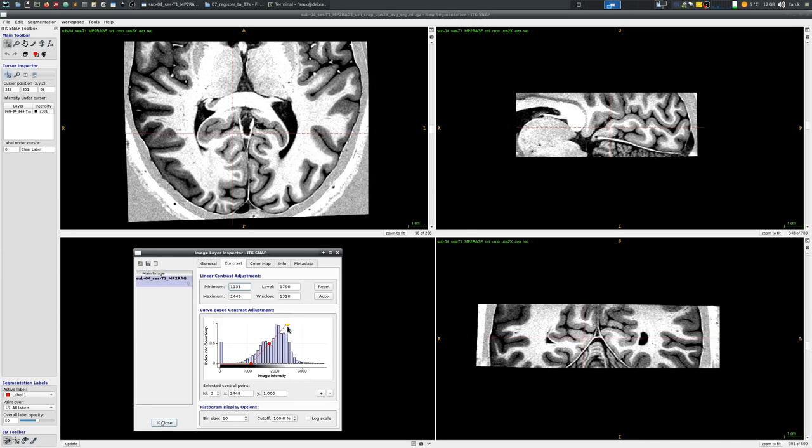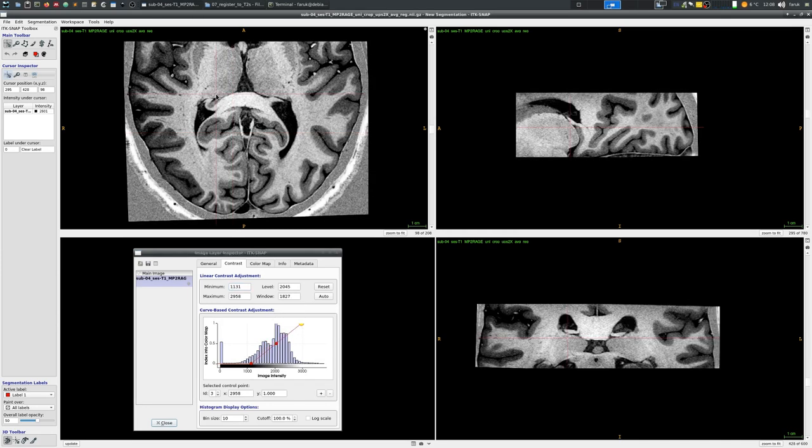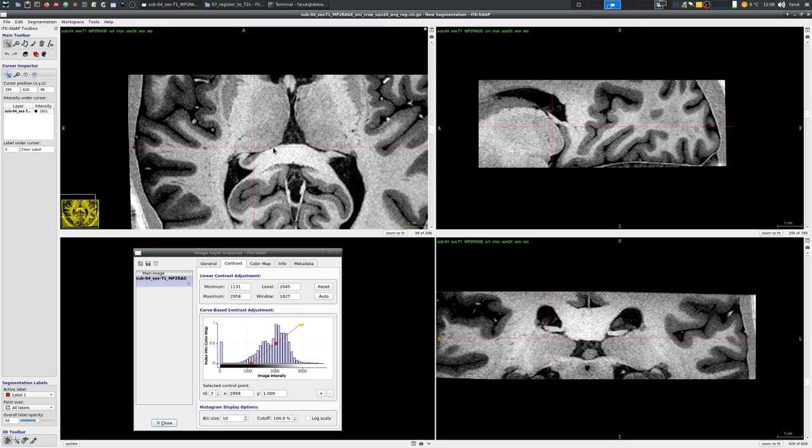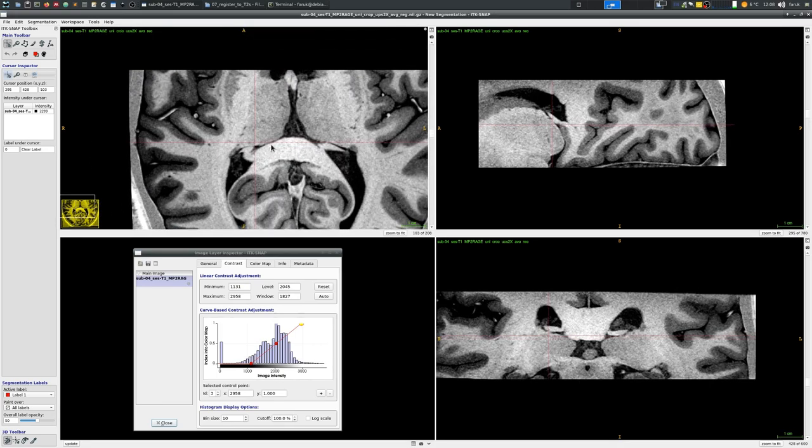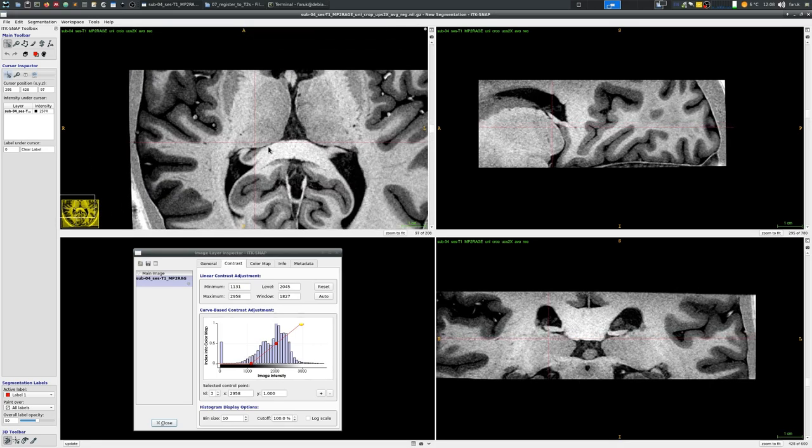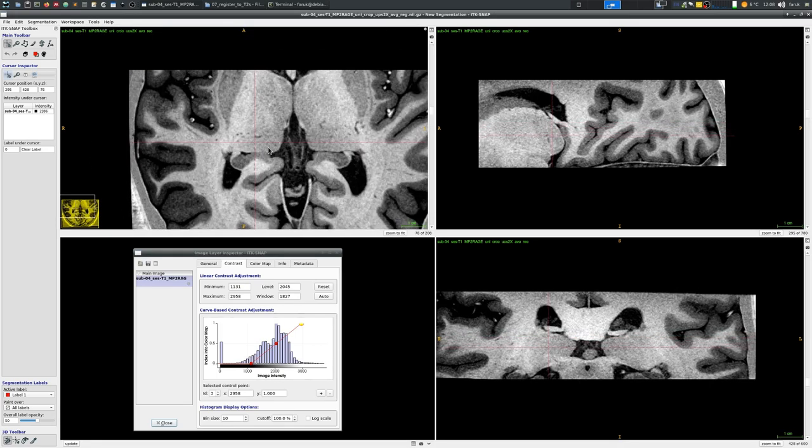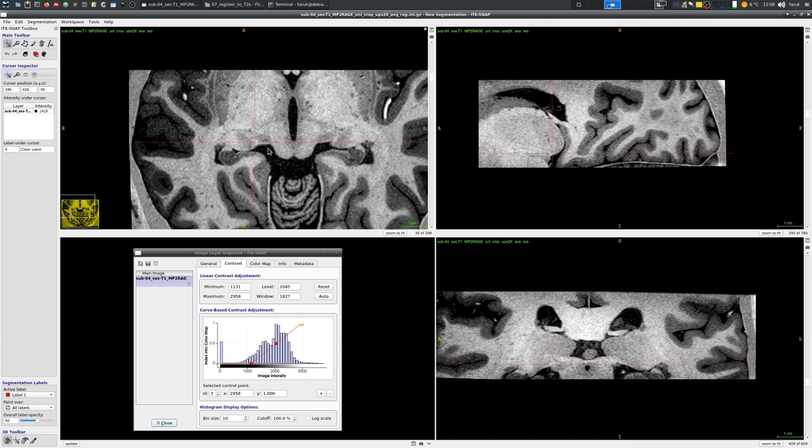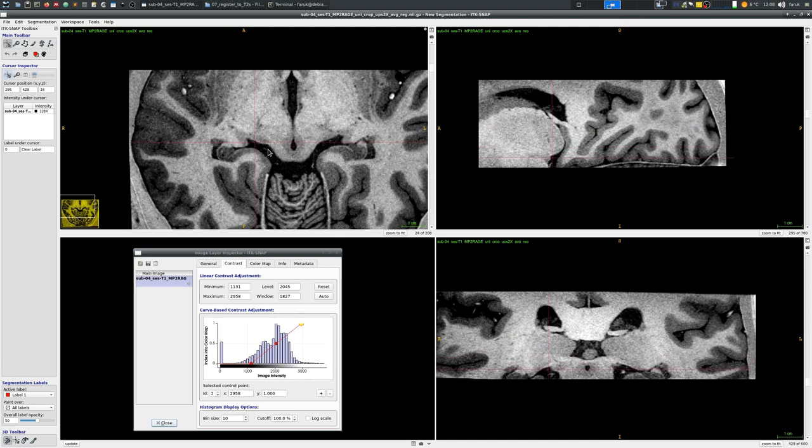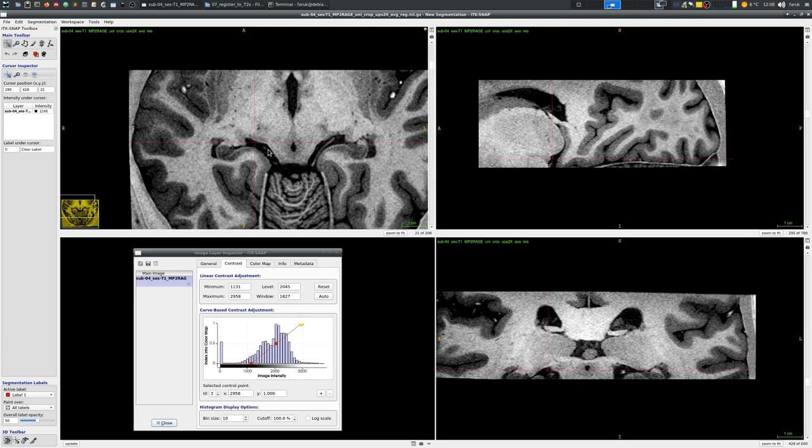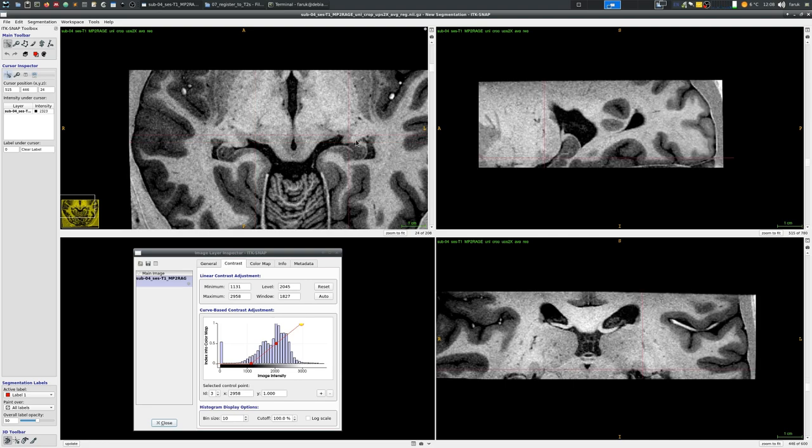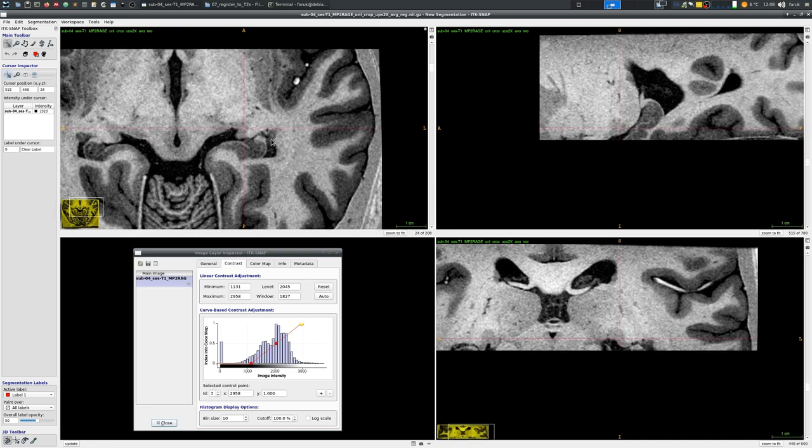Since this is a simple manual segmentation mini tutorial I'm going to show you using this menu to basically optimize the local tissue contrast so that your eyes can easily see the local tissue that you are going to segment and here I'm optimizing it for the lateral geniculate nucleus which you see underneath the crosshair.